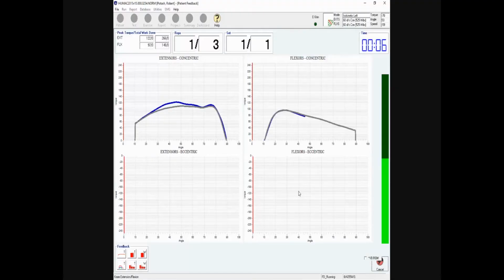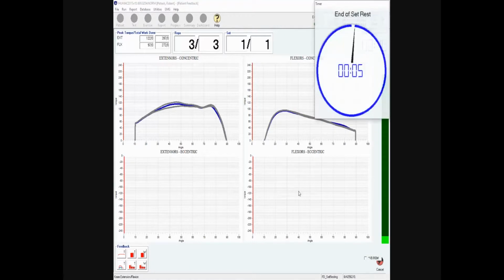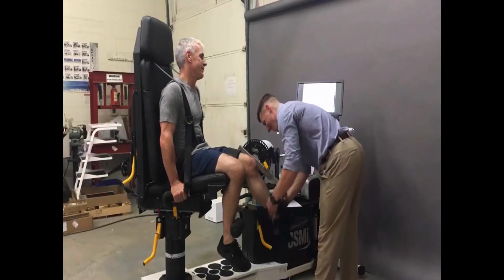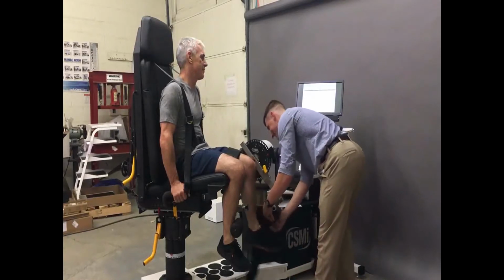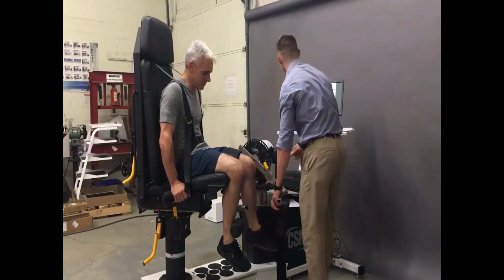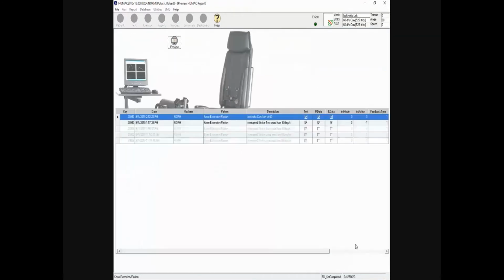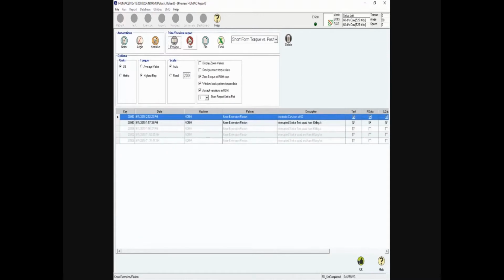And you can see by the shape of his quadricep curve that he is having a problem. He tweaked his knee a little while ago. It's feeling a lot better now, but when we did that interrupted stroke test and we got the eccentric data as well, he had a pretty good eccentric shutdown on that left side in his quadricep. And many of you don't know this, but Rob is actually a very high level competing CrossFit athlete, and he's just coming off of this knee injury, and he's getting ready for the next CrossFit Games, which start very soon.